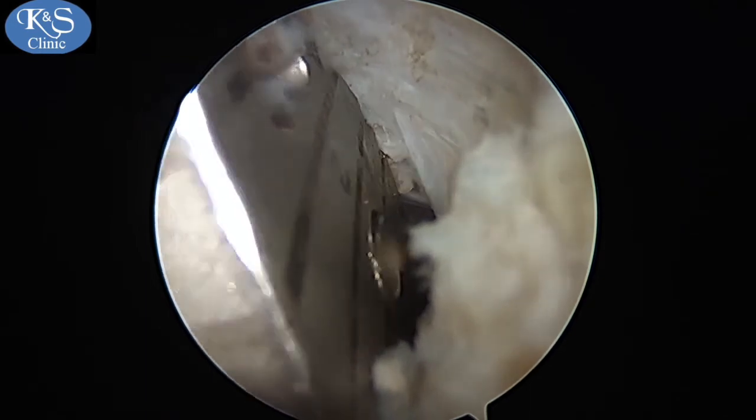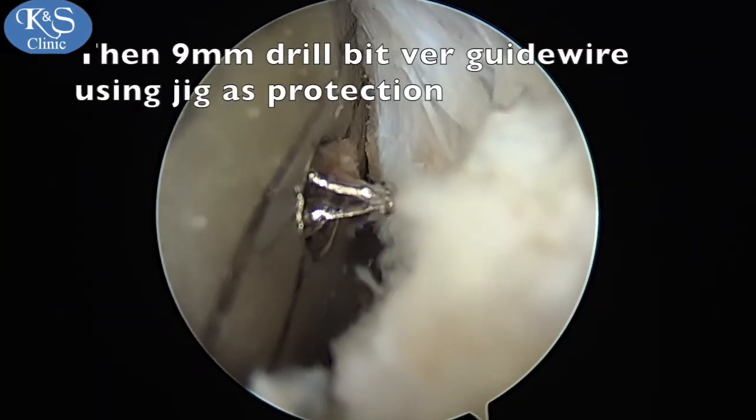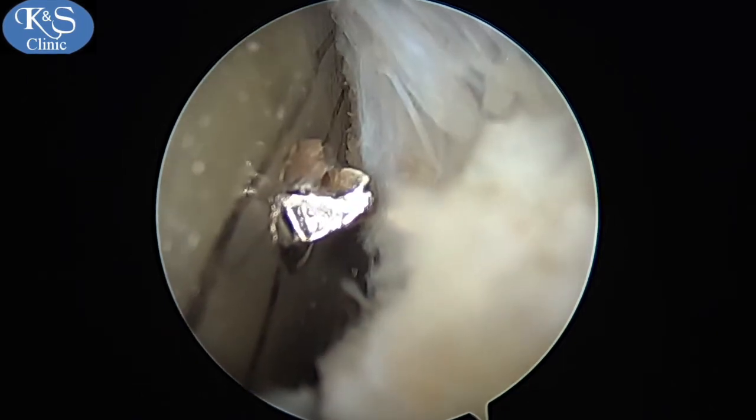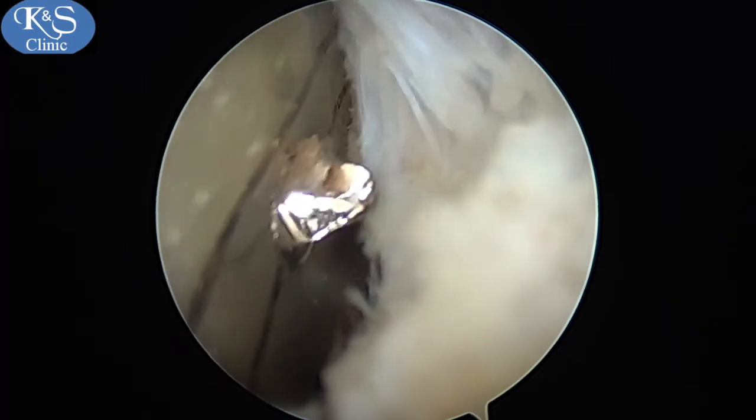You can see the wire now trapped by the jig. It is then over-drilled using a 9 mm drill bit while keeping the wire secured using part of the jig — a trick that prevents any unforeseen injuries.